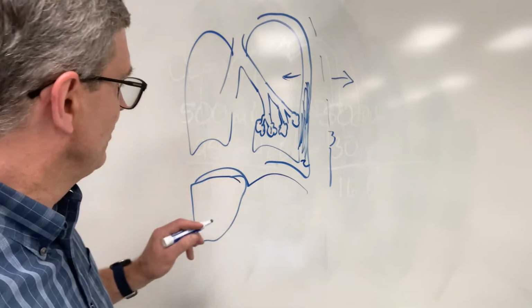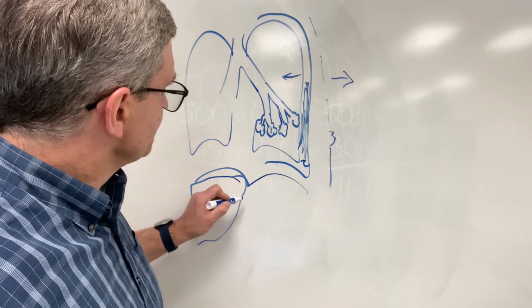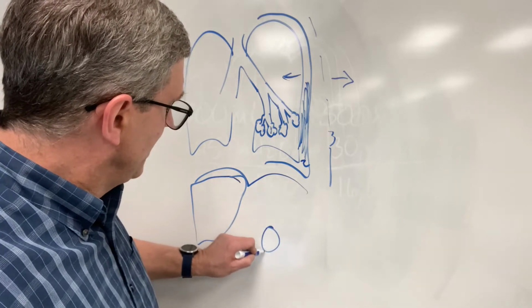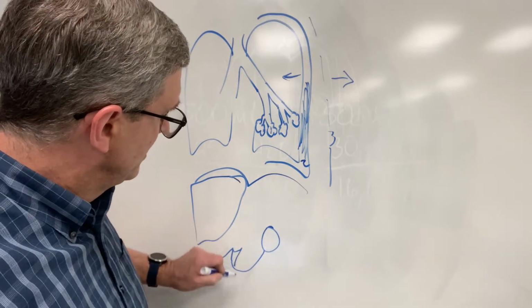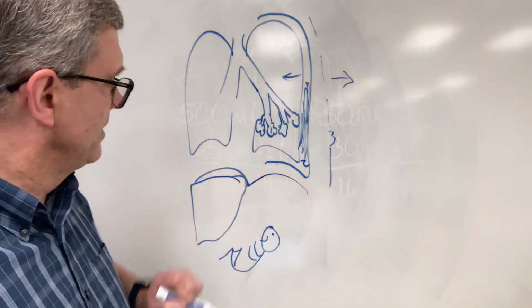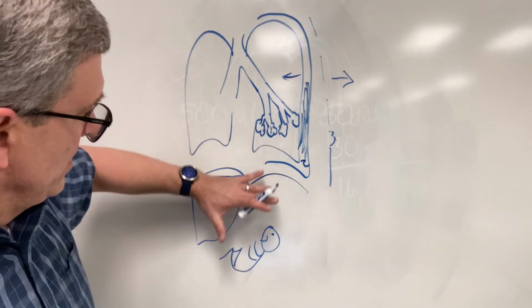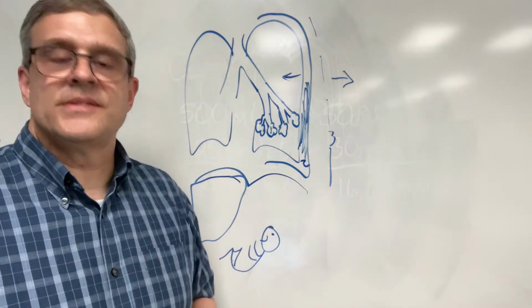It's not a great liver, but or a baby in the way. Well, it's not a very good baby either, but you get the idea. All right. Those are things that the ventilator is going to have to push against.